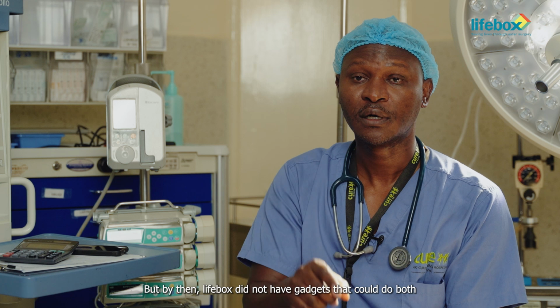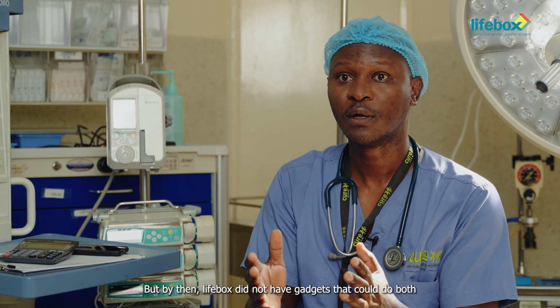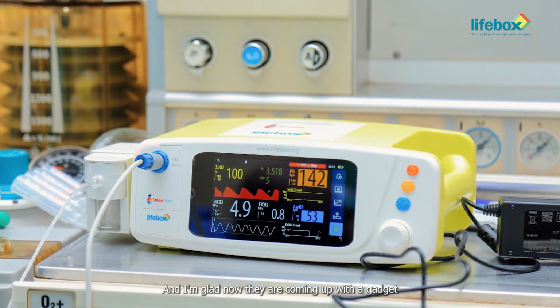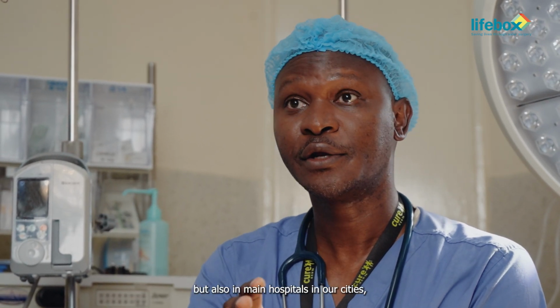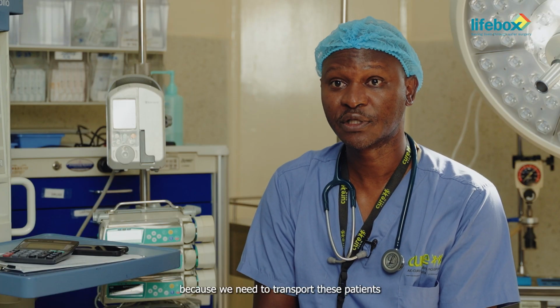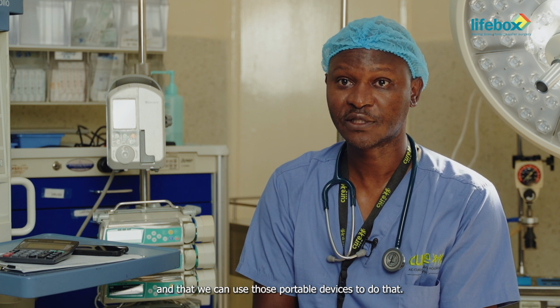But by then, Lifebox did not have gadgets that could do both. Monitor saturations and carbon dioxide levels. And I'm glad now they are coming up with a gadget that can do both, because we really need it in many hospitals, not only in upcountries, but also in main hospitals in our cities, because we need to transport these patients, and that we can use those portable devices to do that.